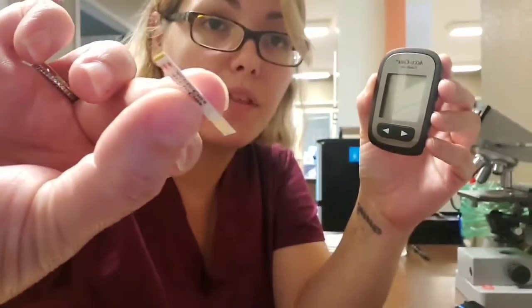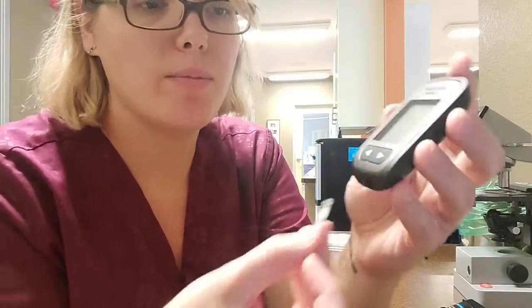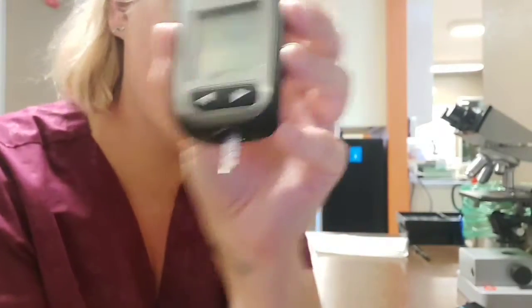All right, so for the blood chemistry portion of the video, I am going to be doing a blood glucose. For that, we just need a glucometer, a test strip that goes into it, as well as our sample of blood, which I have here. We don't need too much. I just used it for my patient not too long ago. So we're going to take our test strip and insert it into the bottom here. I'll let you see this. We have the little hourglass, and then it says that it's ready for the drop of blood.